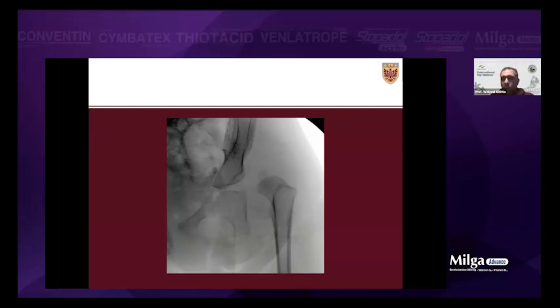Then we'll move to the incision. So we do the adductor tenotomy either percutaneously or with the needle, whatever you're comfortable with. Recently, I'm very happy with the needle, especially for DDH, except for the CP. And how about the incision, bikini incision? Thank you, Dr. Harris. So bikini incision, and how we mark the bikini incision.